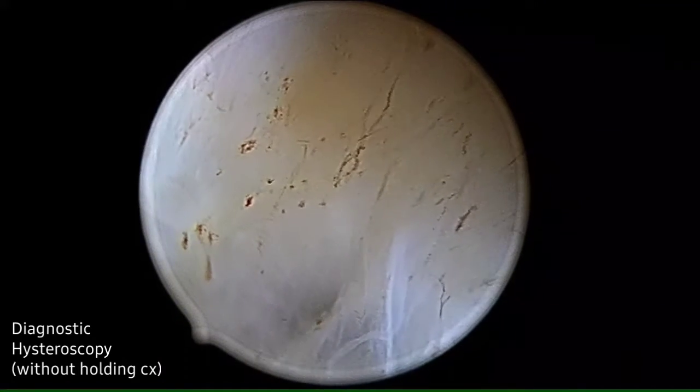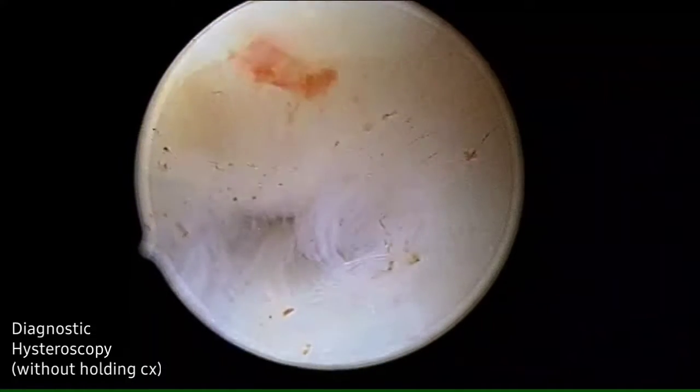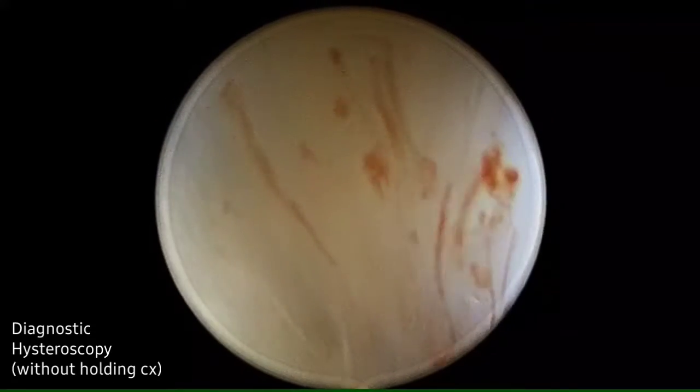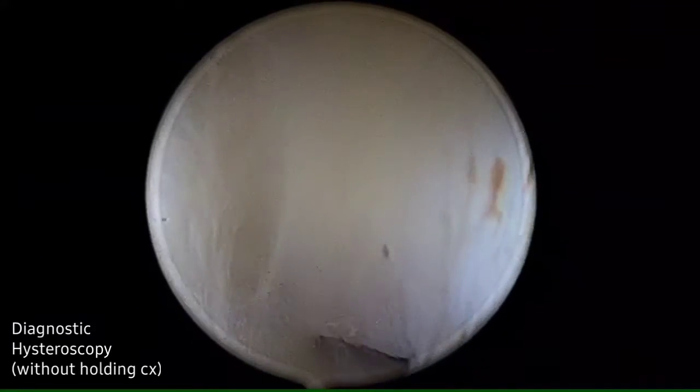So here the opening is clearly seen with some flimsy tissue, and again the scope is withdrawn to confirm it and to locate. Some endometrial tissue was peeled off, but it is not a false passage, and with gradual and gentle pressure the uterine cavity is eventually entered.